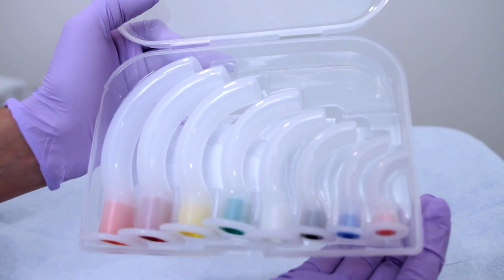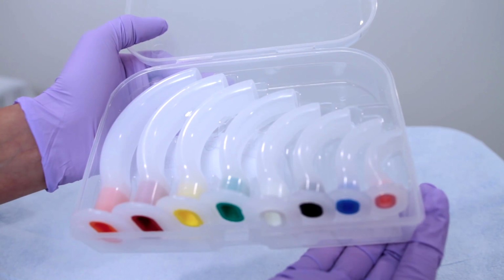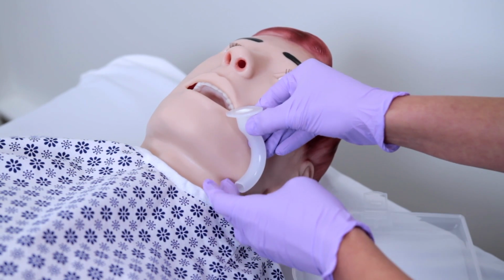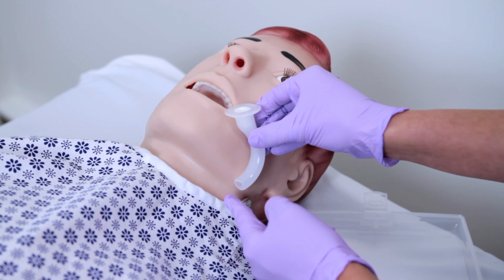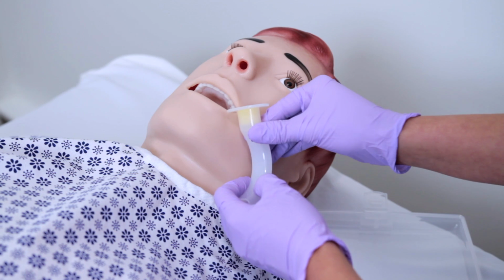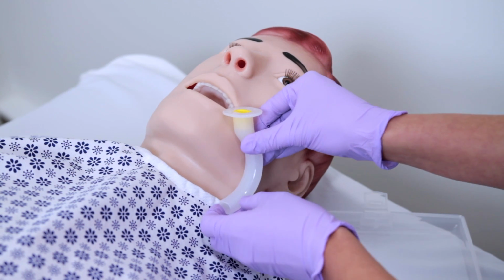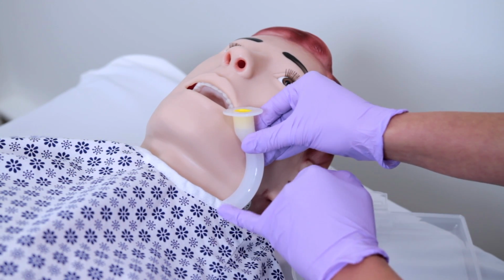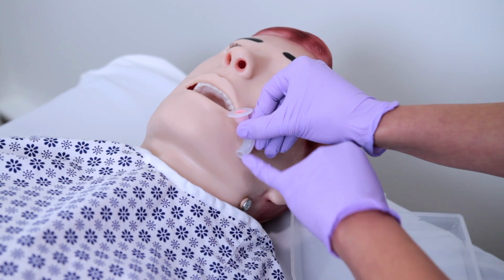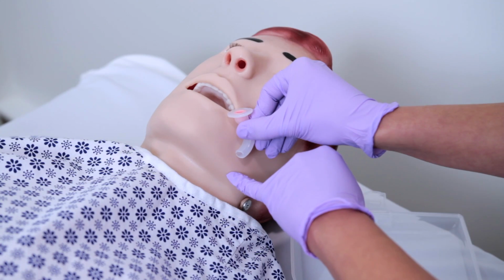Now, there are different sizes of an OPA tube as shown here. So how do we size it? Sizing is important, so be sure to place the opening of the OPA at the edge of the patient's mouth and the curved tip at the end or angle of the mandible. If you notice, this OPA is too long and goes past the mandible, as it would not be an ideal fit, and this OPA is too small or too short as shown here.